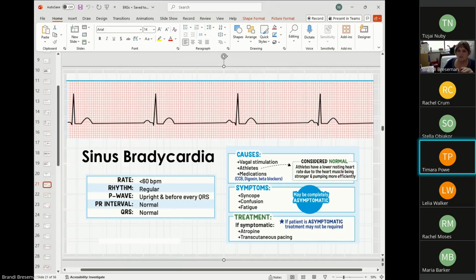Okay, most of you. So with the defibrillator comes patches, right? Back in the olden days we had paddles, but now we have patches. And so the patches either go one on the front, one on the back, or one here and one here. Okay. But you're going to put your patches on, and you are going to put it in what's called pacing mode. And so it's not going to shock them like we do if they are in cardiac arrest, but it is going to deliver enough electricity to, first you have to capture.